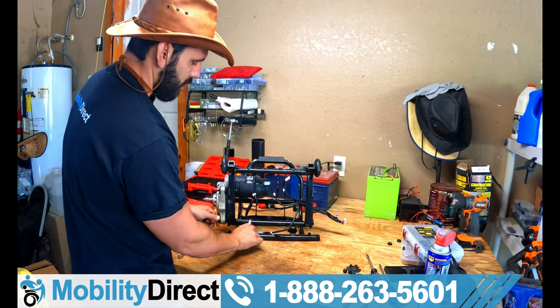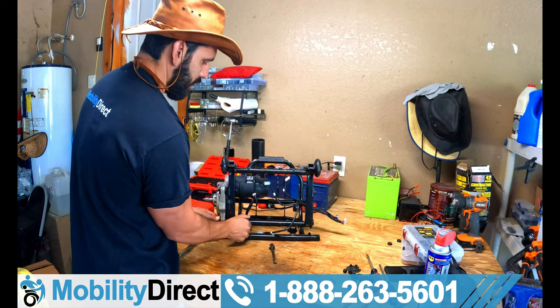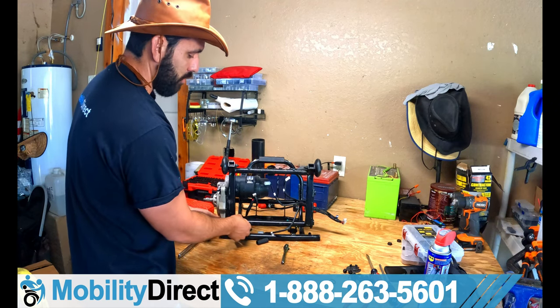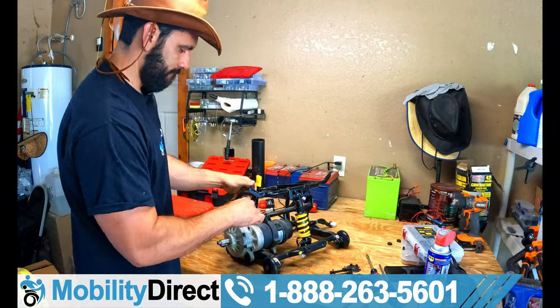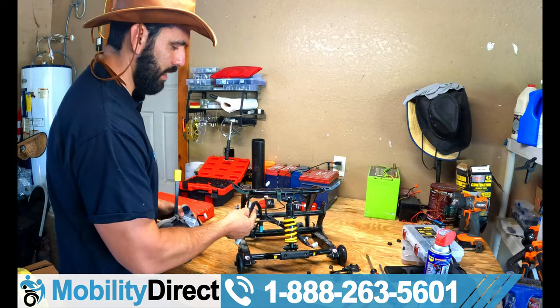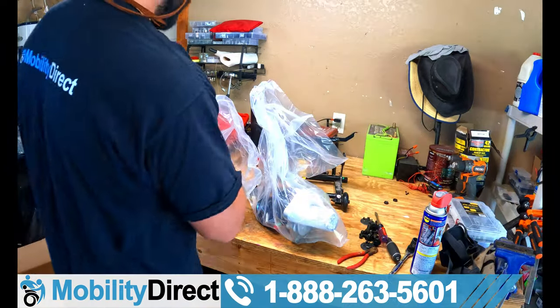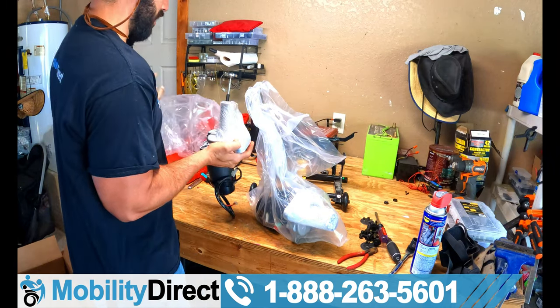I'm going to fast forward through removing the second motor and we'll restart once we have the left motor removed. Left motor is removed. Just going to detach the red and black connector from the main harness and we are good to go. Here we have our new motors from Pride Mobility.